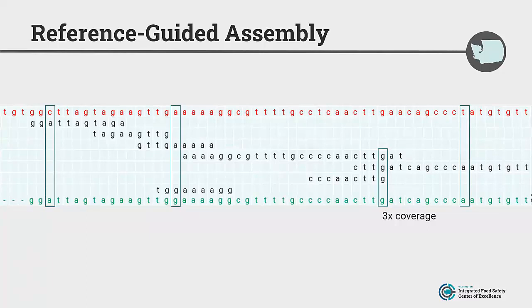So there's a lot of quality metrics that your scientists are looking at to assess whether the genome is good enough quality to analyze. So if you ever get a report back from the lab that they need to rerun a specimen, this is just one of the many quality checks that they're doing to make sure that they have good data to provide you.